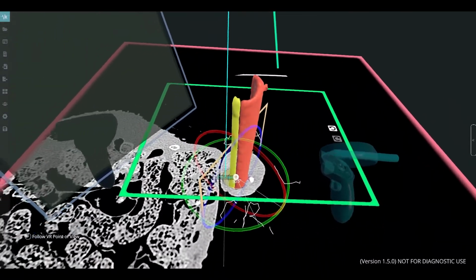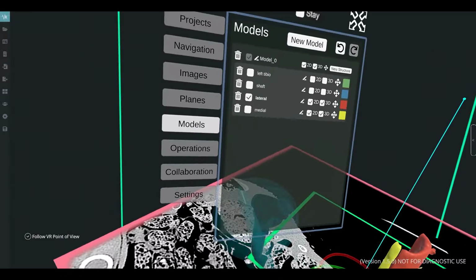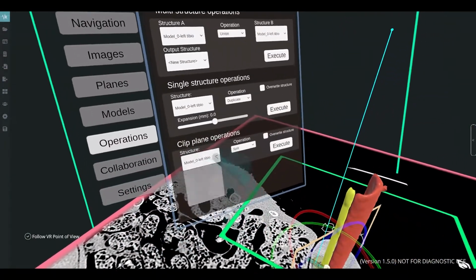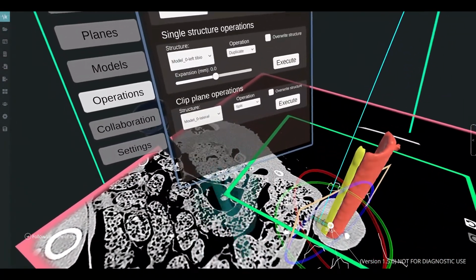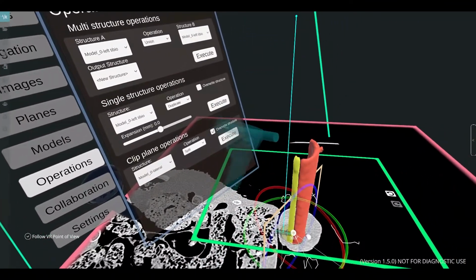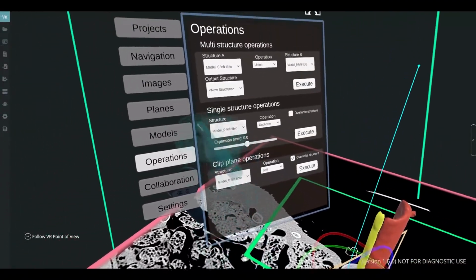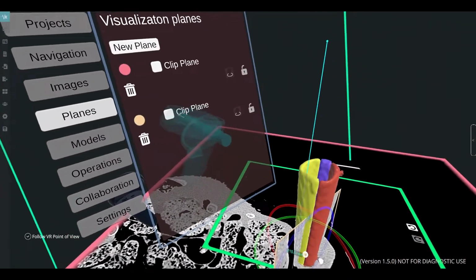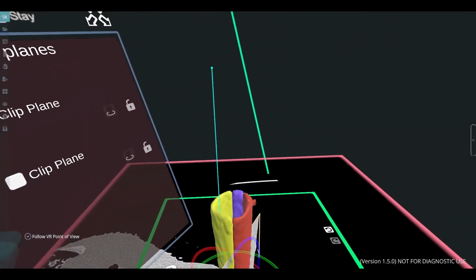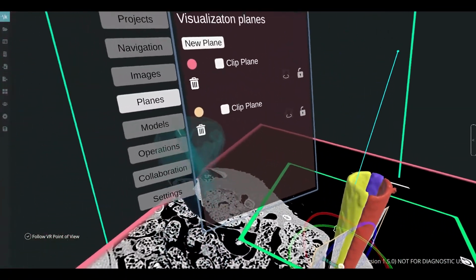And when you export, if you keep that clipping plane and don't discard it, it'll tell you where that center is. It'll give an X, Y, and Z coordinate, which could later be used to measure the distance these areas are going to be away from the center. Okay, this time I'm overwriting it because I don't need that lateral model for anything. So now I've overwritten it, so I split it into two.